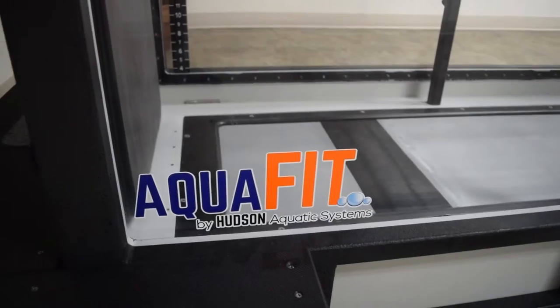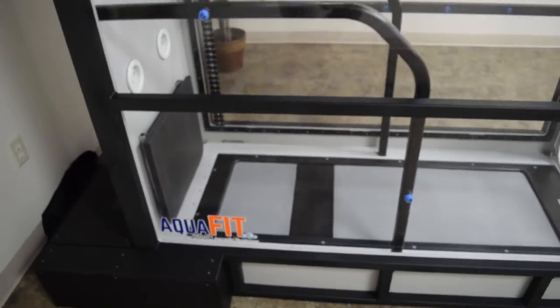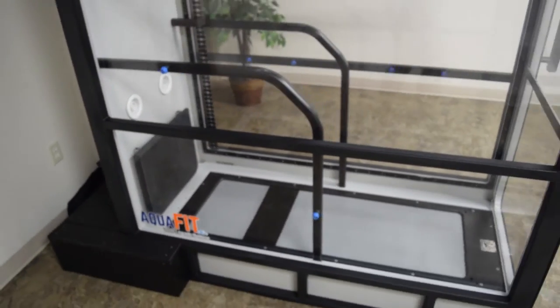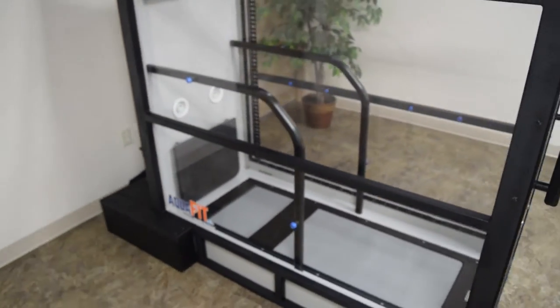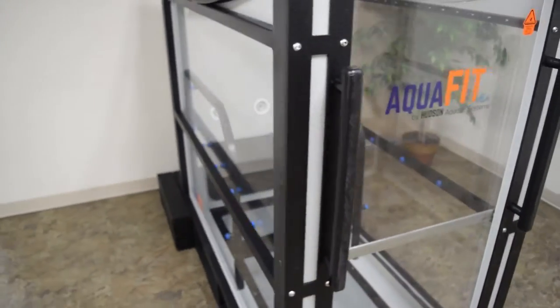Today we're exploring the custom design features of an AquaFit underwater treadmill from Hudson Aquatic Systems. It's the ultimate in hydrotherapy and fitness.